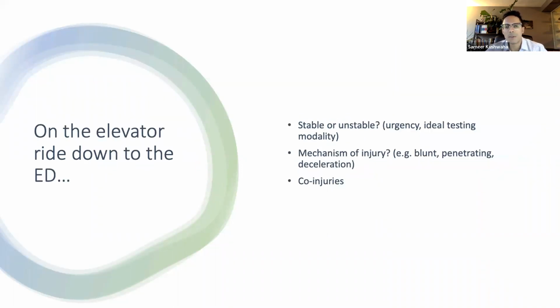So when I'm thinking about the trauma patient that I've been called to assess, as I'm going down to the emergency department, I'm always asking myself a few important questions. Number one, I'm trying to think about if they are stable or unstable, as this will affect how quickly I need to get to the patient and do the echo. But also whether I have time to gather collateral clinical information, or if I can get other tests such as CT scans to corroborate my findings.